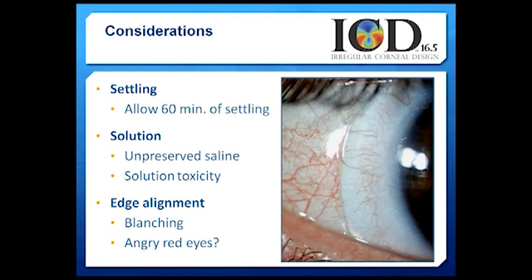With scleral lenses, we're able to achieve the comfort of soft lenses because the lenses don't move. But a side effect that we need to be aware of is that they trap the fluid in there. So don't be surprised if your patients need to refresh that fluid at some point during the day.